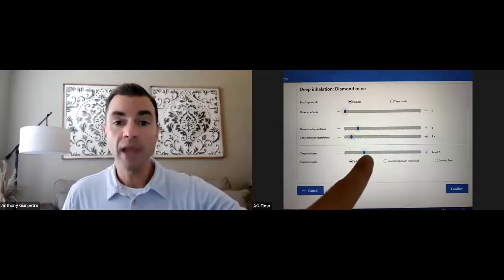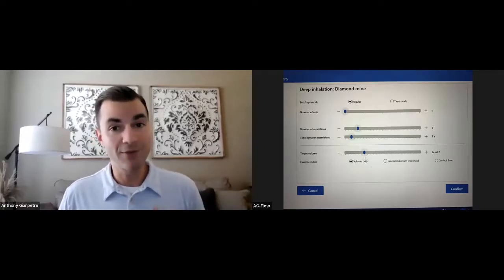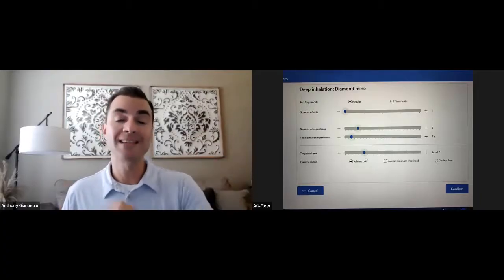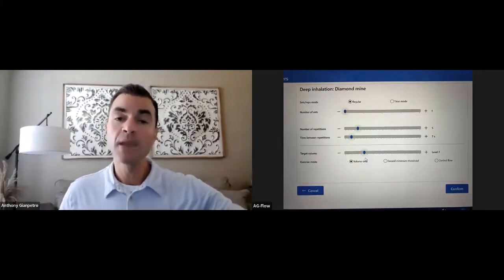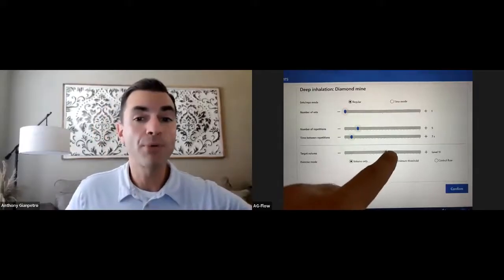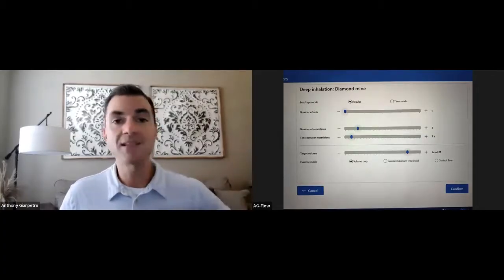So you see the target volume, and you might remember me referencing before that the presets of 10 or 7 may or may not fit your patient. It certainly doesn't fit it for me. If I were to do this activity at level 7, I would barely have to inhale before I successfully completed the activity. So what I want to show you here is if I was your patient, you would know right off the bat, well, Anthony did an assessment. He was around 20, 24 for the volume of air that he could do. Why don't I adjust this parameter up then somewhere around there so that this is a more appropriately tailored exercise for his ability? So that is the crux of what we're trying to do.